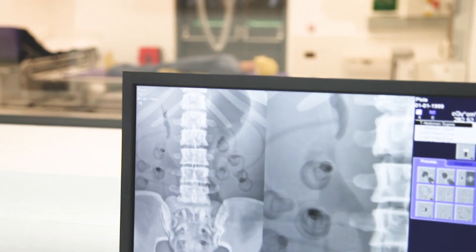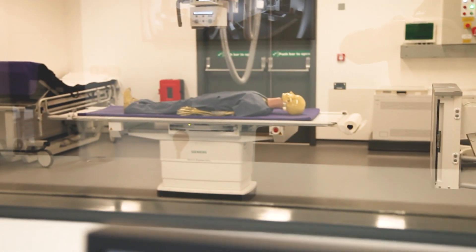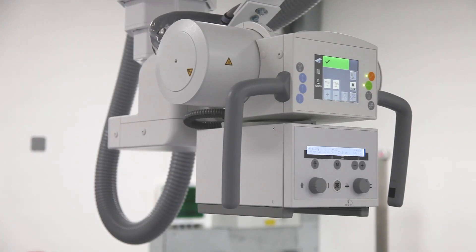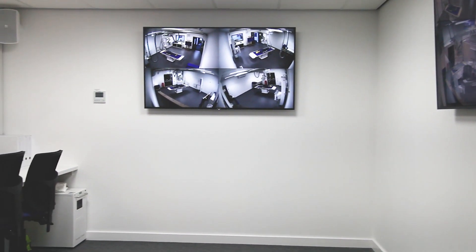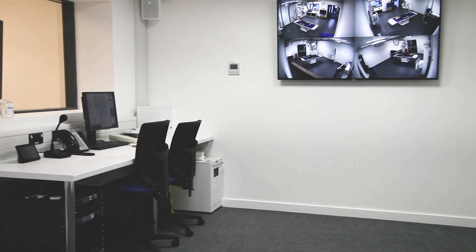The fully digital means that the images are taken of the phantom and pushed immediately electronically into our observation area, which makes it very user friendly for our students.